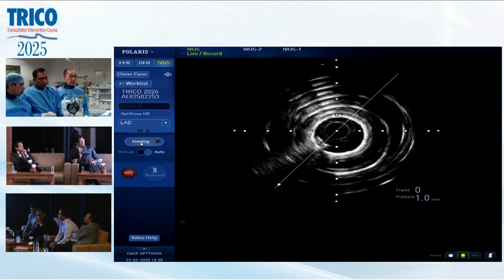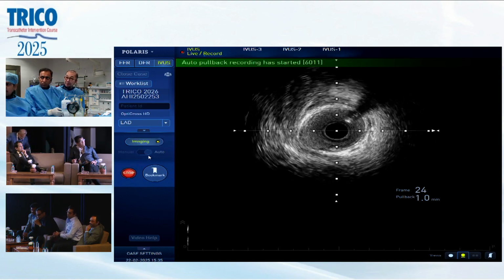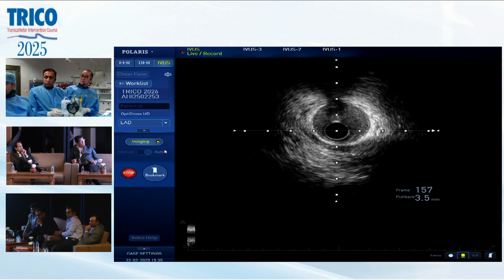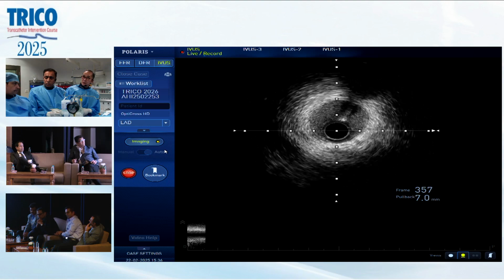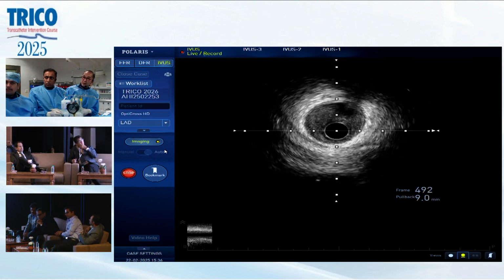Routine kissing is not a good idea nowadays in provisional bifurcation stenting. But if you have OCT, you exactly know how many struts there are and what the crowding is. Here in IVUS, at times it is difficult to judge. So how do you decide? This is a problem for IVUS, but sometimes, hopefully, we're lucky and can see.